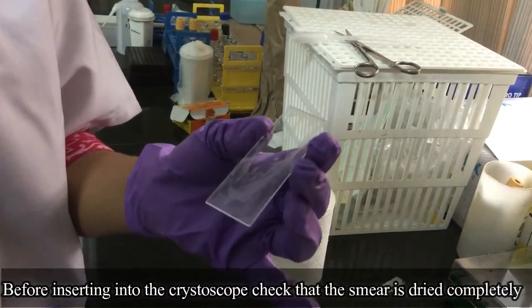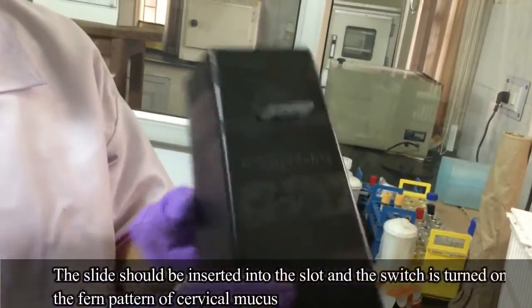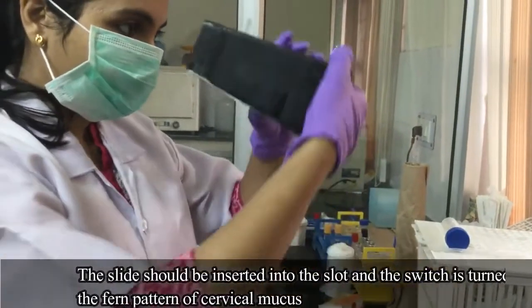Before inserting into the CrystalScope, check that the smear is dried completely. The slide is then inserted in the slot and the switch is turned on to see the fern pattern of cervical mucus.